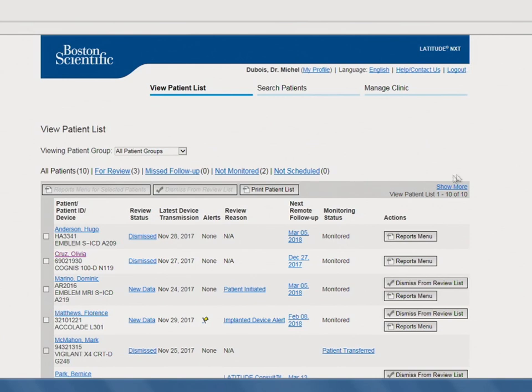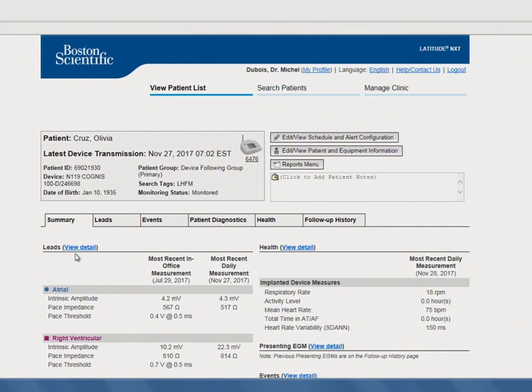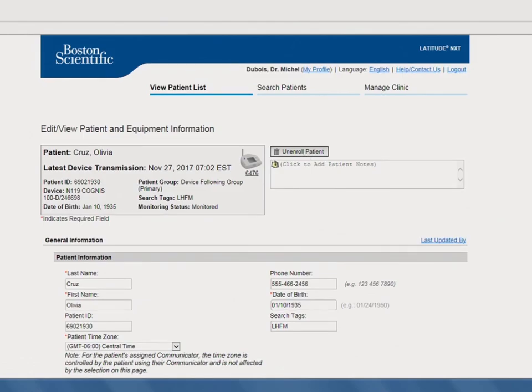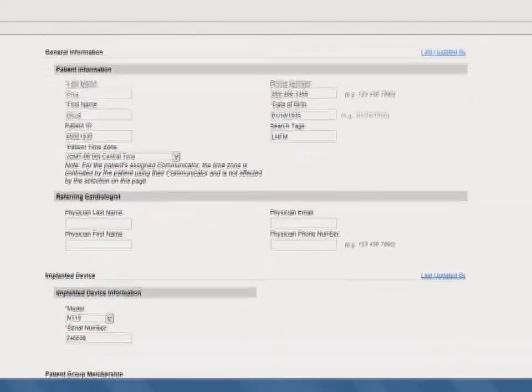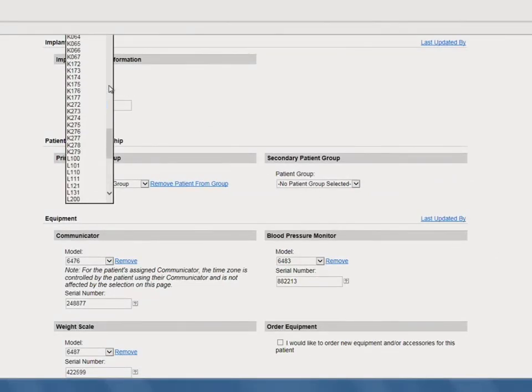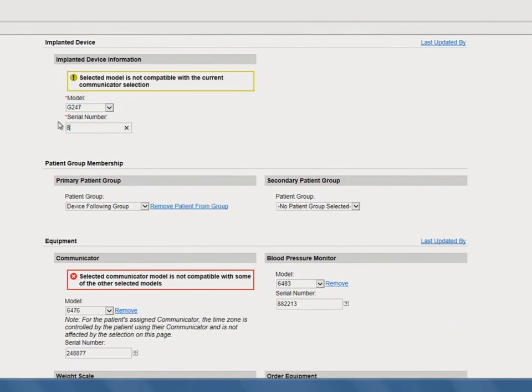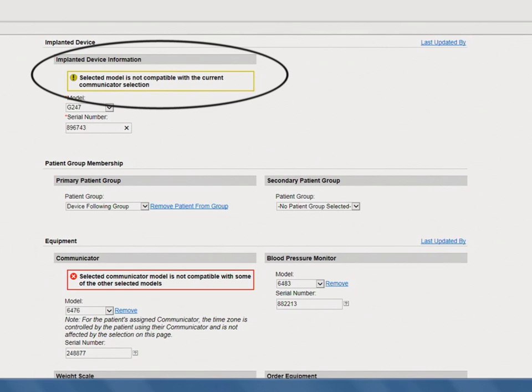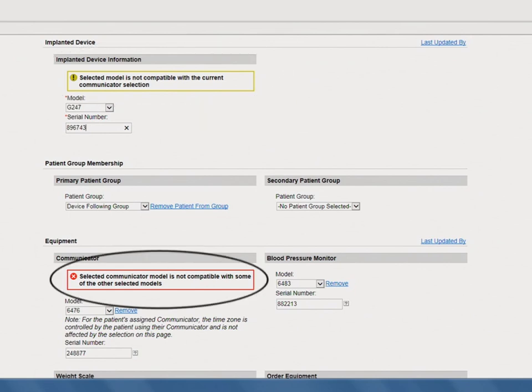Once a patient has their device replaced, find the patient in Latitude Next and click on their name. Next, click the Edit View Patient and Equipment Information button. Scroll down to the Implanted Device section and update the patient's implanted device model and serial number. After updating the implanted device model to a device that is not compatible with the current communicator, two messages will appear on your screen: the first in the Implanted Device Information section, and the second in the Equipment Information section.